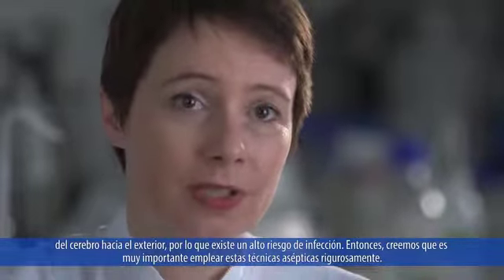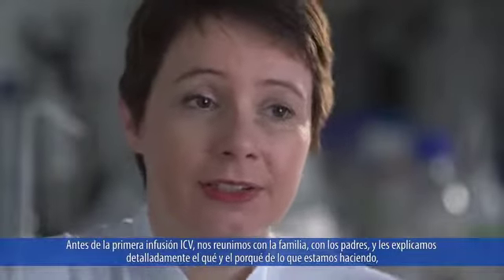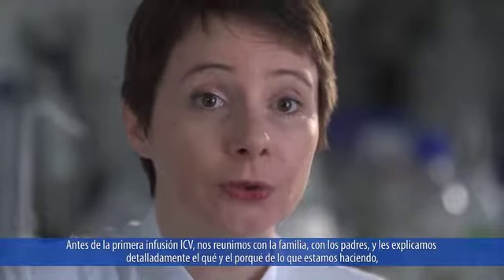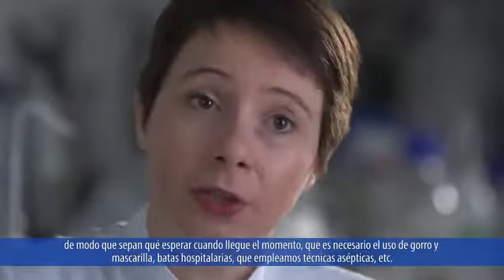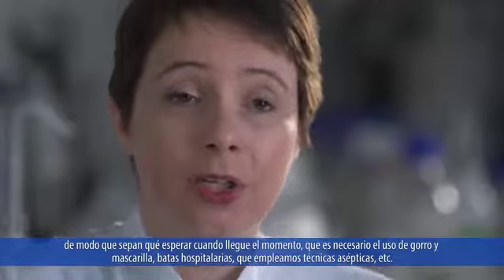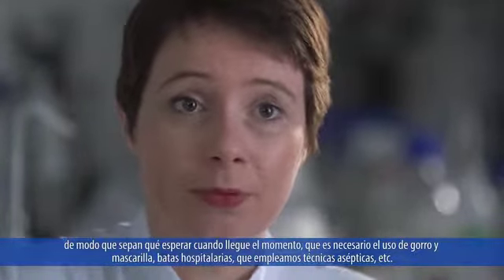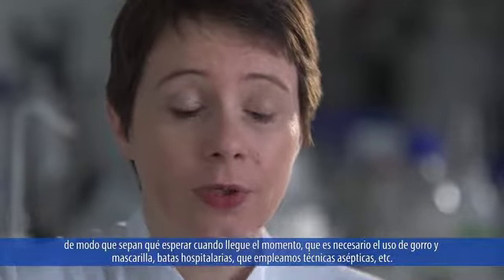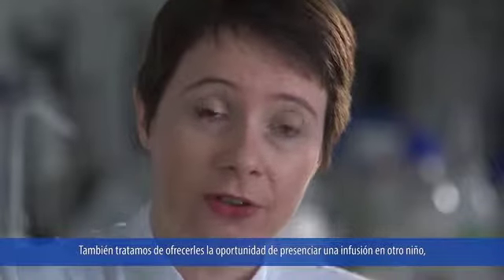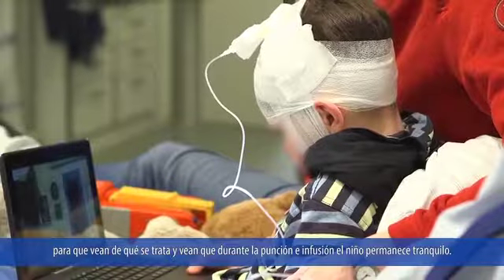Prior to the first ICV infusion, we sit together with the family, with the parents, and explain to them in detail what we are going to do and why we are doing this, so that they know what to expect and what's going to happen when. So they know that they would have to wear a cap and a mask, and that we gown ourselves up, that we work on a sterile technique, etc. We also try to give them the opportunity to watch an infusion in another child, so that they see how it's happening, and they also experience how relaxed the children are during puncture and also during infusion.